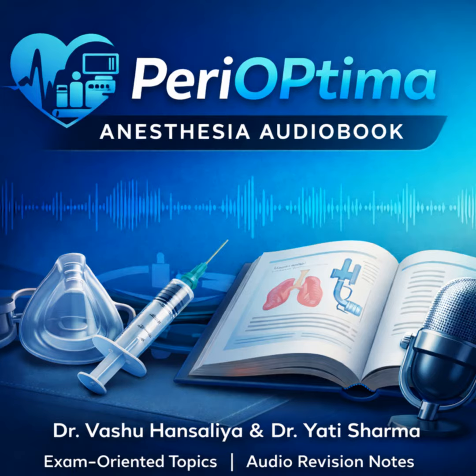Failure to advance the tube. The railroading failure. Impingement. It happens all the time because the tube's bevel catches on the arytenoids or the anterior commissure. We have a few troubleshooting steps. Okay. First, if your view is obscured by secretions, try insufflating oxygen through the working channel to blow them away.